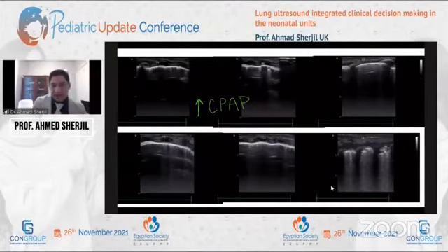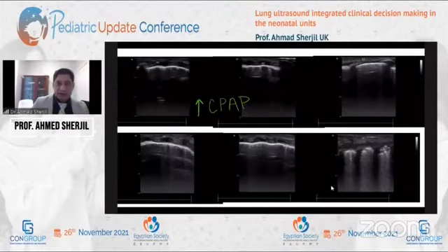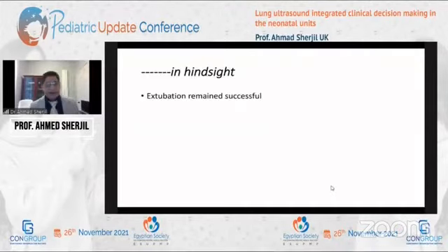But this is how lung scan can enable you to do a very accurate sort of troubleshooting, and then to be able to bring this evidence to your team and say, okay, don't worry, we are heading in the right direction. We're not heading towards a reintubation. It is pretty remarkable. And in hindsight, this patient, everything happened to him, but he was never reintubated again.